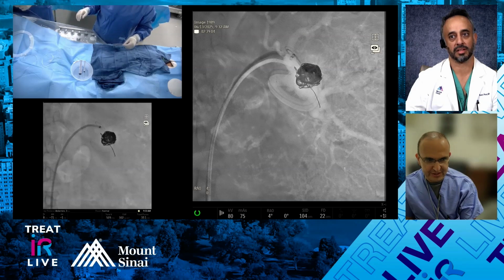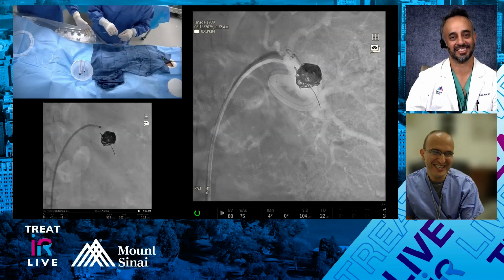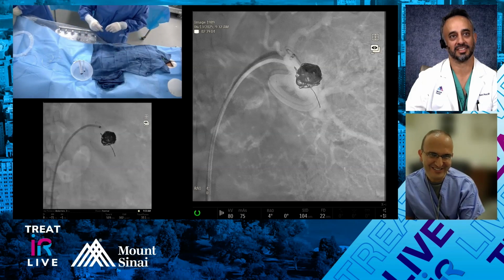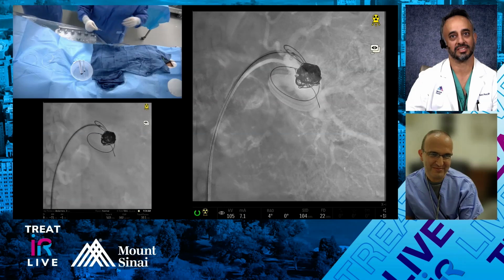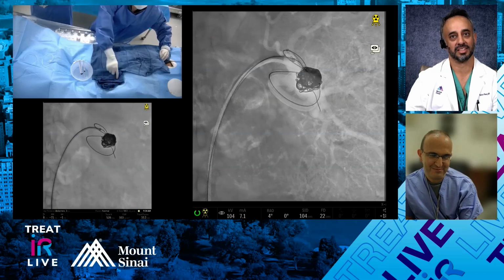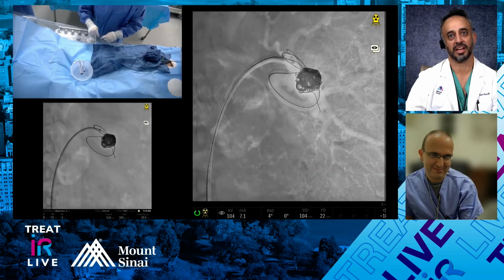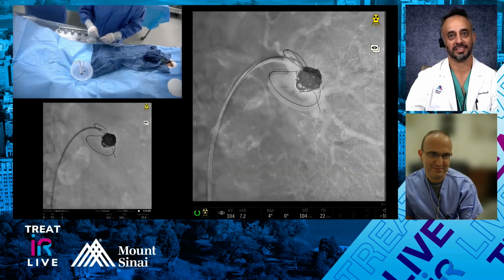Yeah, the push-pull coils are great until your last one, is a joke that I tell them. Exactly. I'm sure we've all felt that during training quite a bit, where you want to just get one more coil. It's all out of good intentions, but that last coil can really hurt you sometimes. Yeah, I always say the first and the last coil are the two hardest to put in. Absolutely.